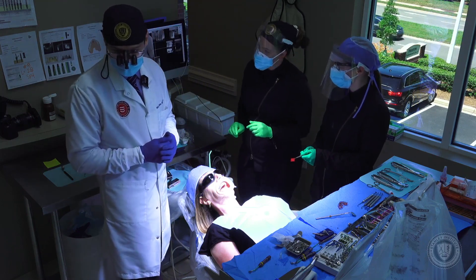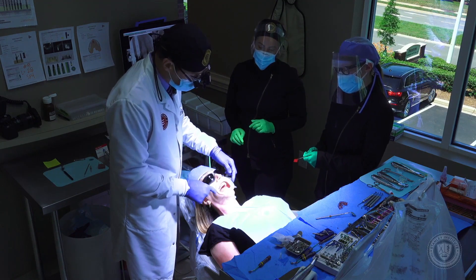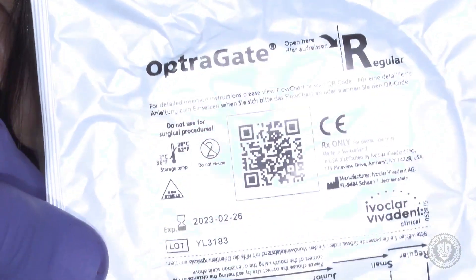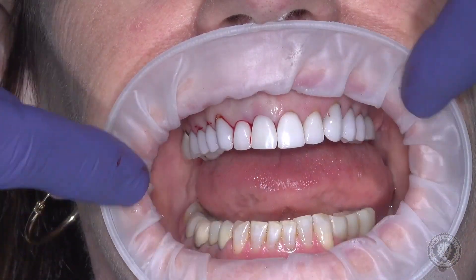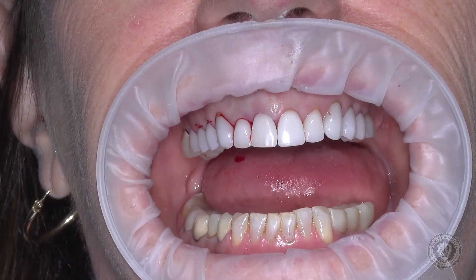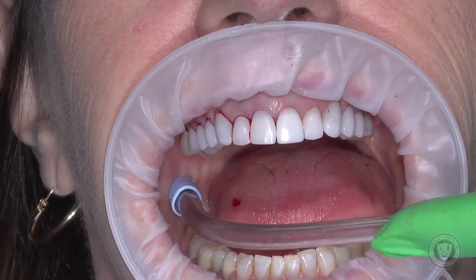This mouth prop is called an OptraGate, sold by Ivoclar Vivadent. We love this for a couple of reasons: it protects the patient's lips, and because of its milky white color, the light bounces around inside and it really lights up the oral cavity nicely, showing us exactly what we need to see. We like that product a lot.